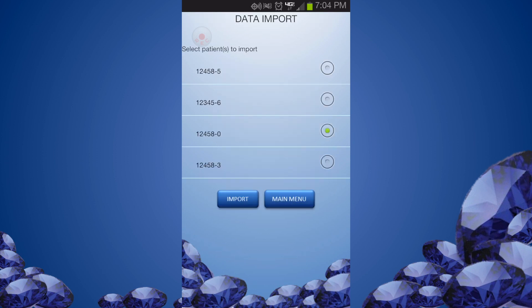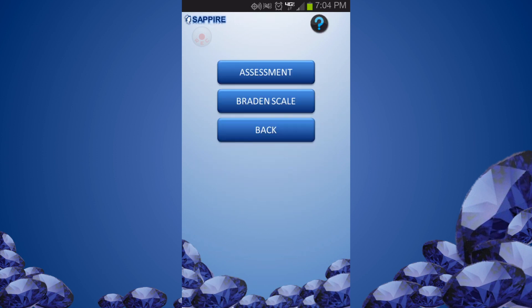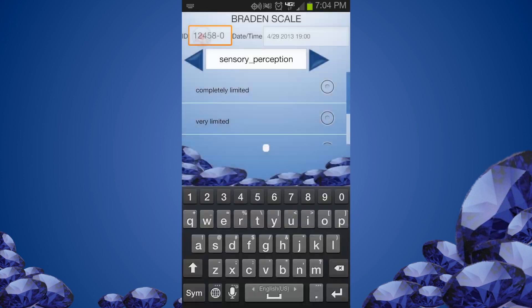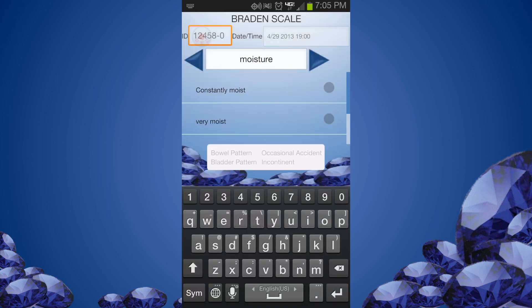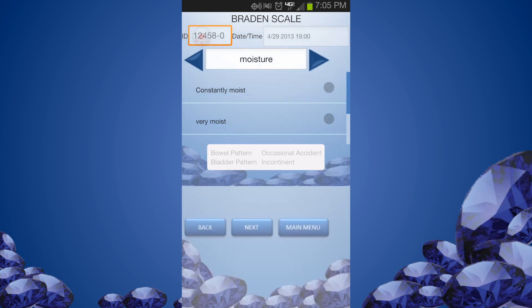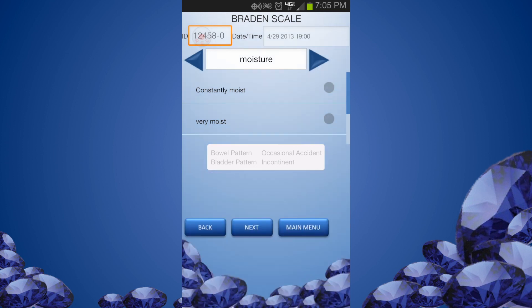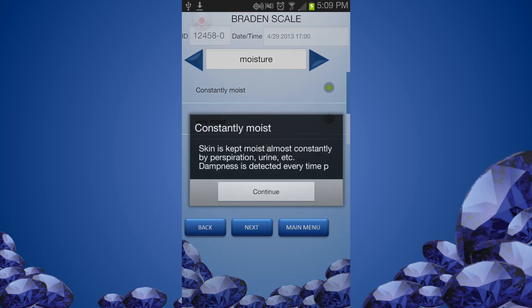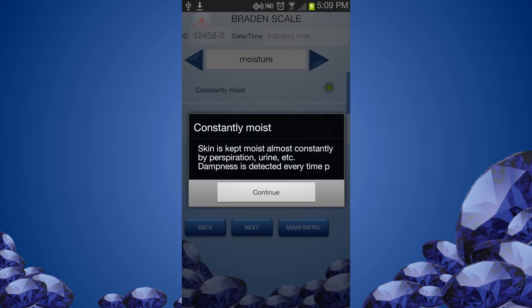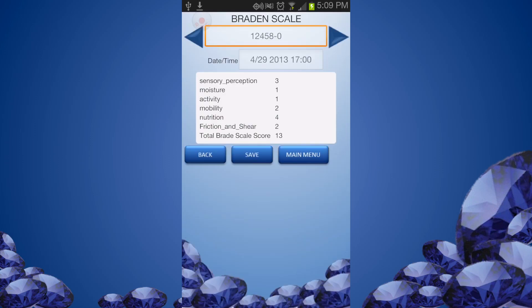From the Record Assessment menu, select Braden. The relevant patient data we associated during the configuration step are now displayed for your reference. You can check the definition of each score by tabbing the score options. Move to the next parameter using the scroll arrow. When you complete the Braden scale assessment, the review screen shows each parameter score and the total Braden score.